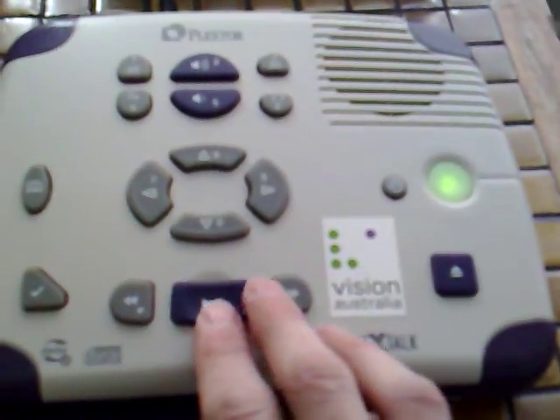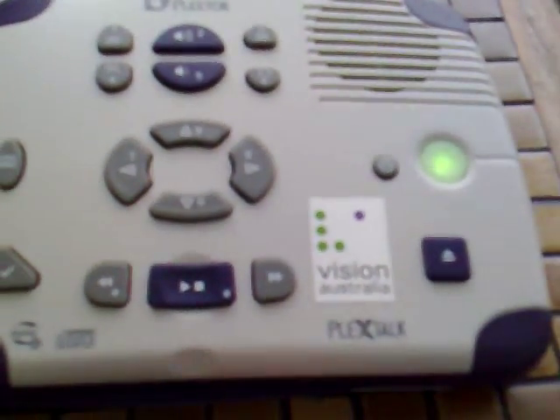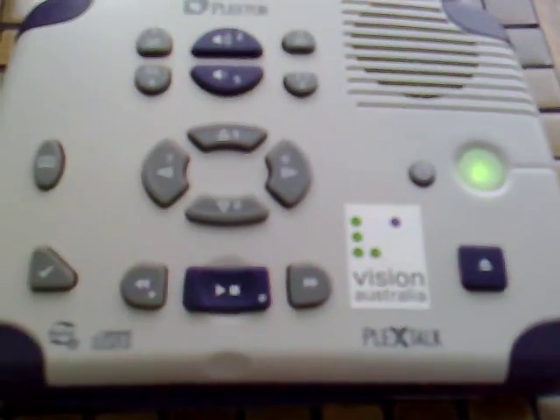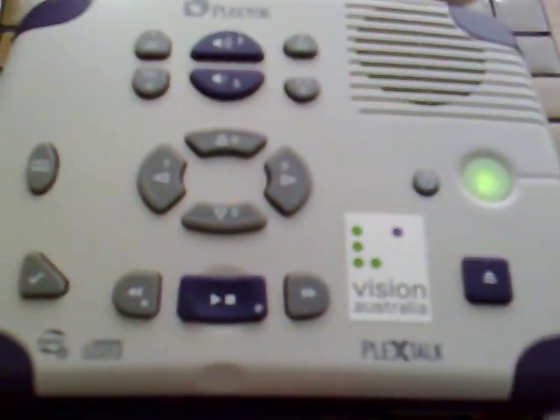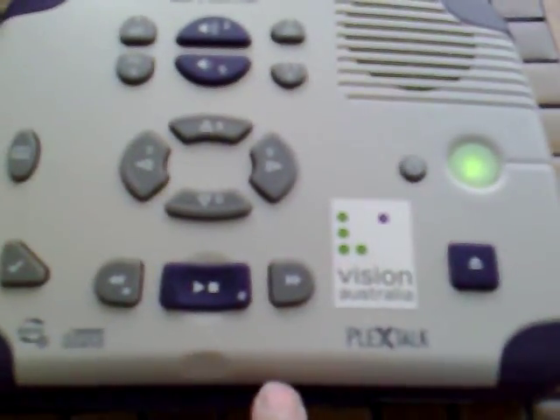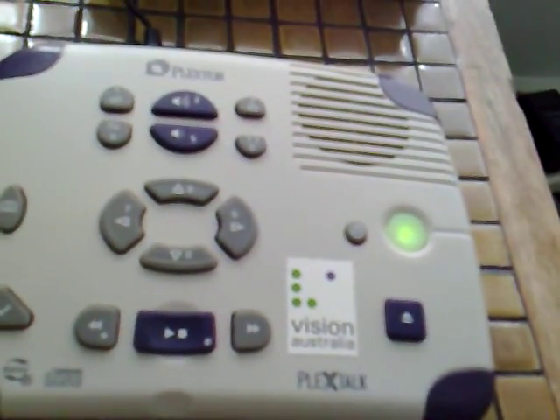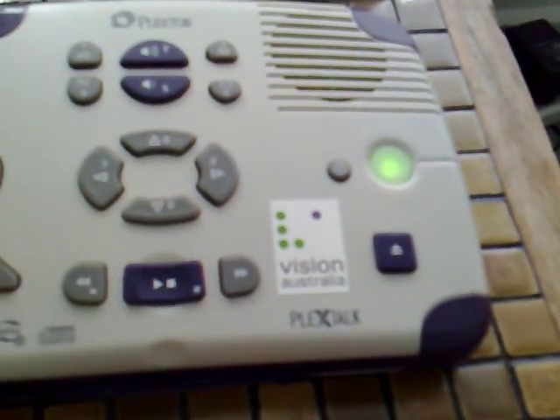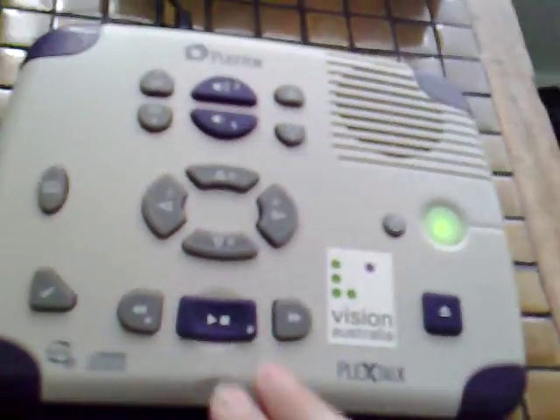One of the other nice things is I can speed the book up and make it play very quickly. Pressing the speed up button takes it to plus eight — and now that's incredibly quick. I'll slow it down back to normal speed, and I can also slow it below normal — minus two — which slows the narration right down.